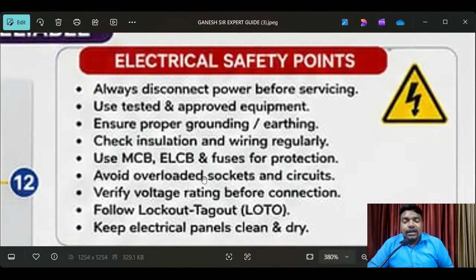If you find any variations, immediately take a picture, make a service report and inform the hospital management. Resolve the issues immediately, otherwise you will get a major problem. As a biomedical engineer, you have to give the instructions to the hospital management. Then only they come to know and are ready to replace, because they know the value of the equipment, since they bought everything.